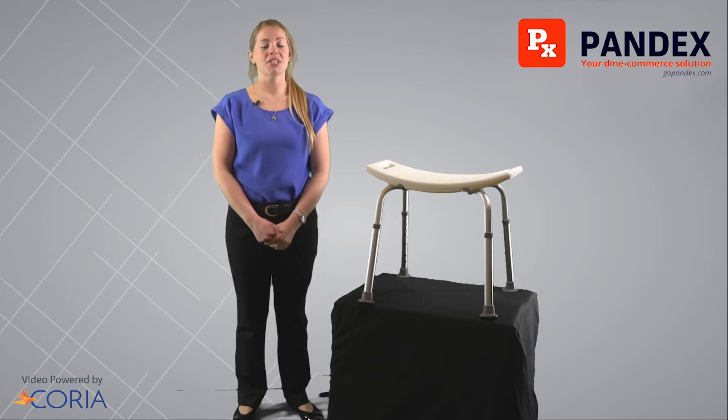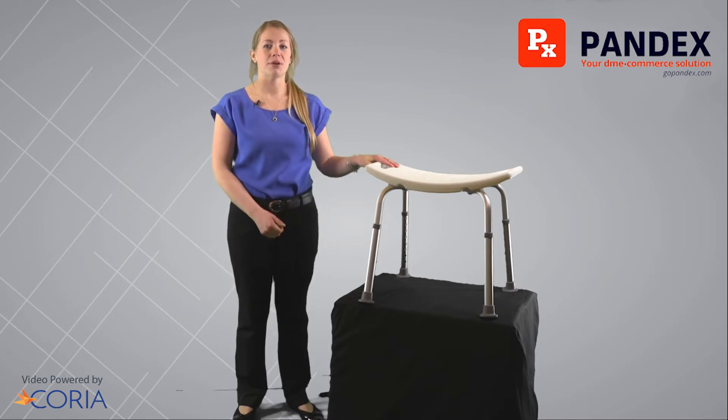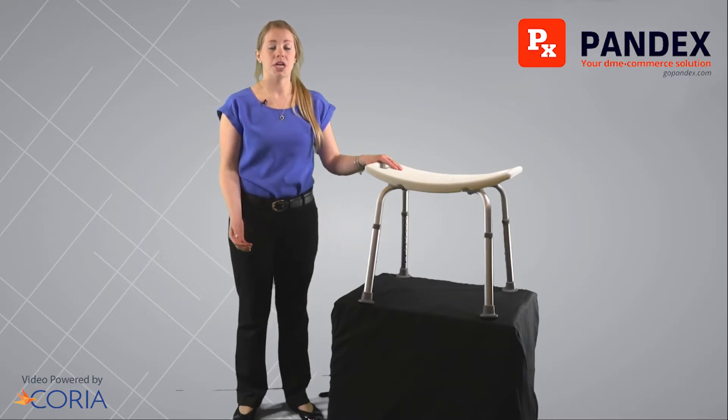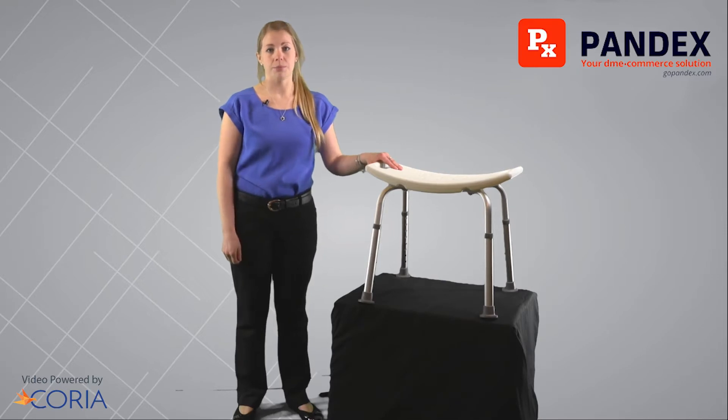Hello, my name is Diana and welcome to today's Pandex video on the shower chair. The shower chair can come with or without a back and is a great portable chair to use in your shower or your tub.